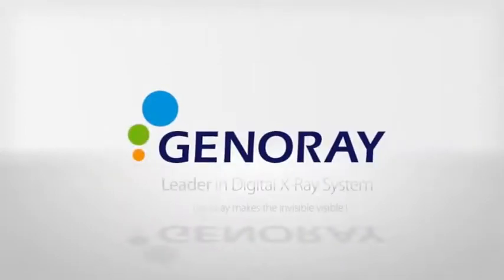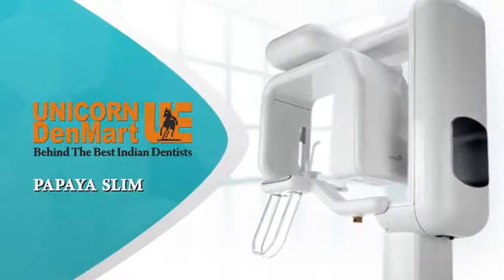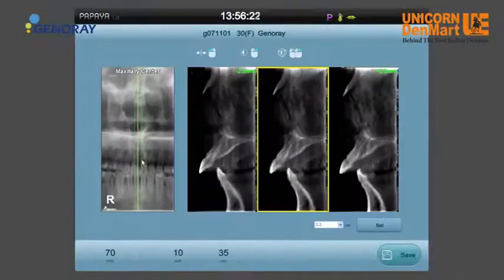Genoray, South Korea, a leader in digital X-ray systems, has joined hands with Unicorn DenMart Ltd to bring you an advanced digital OPG system with the Papaya Cust feature.